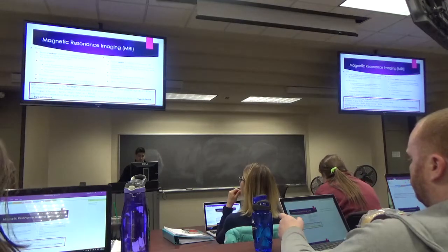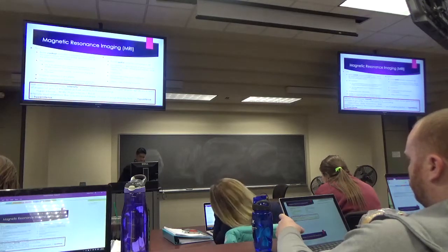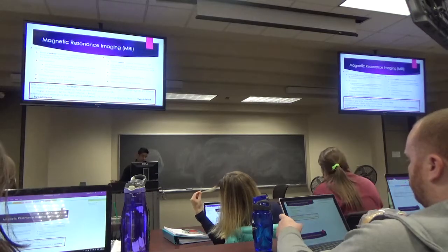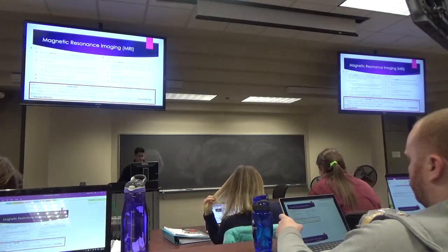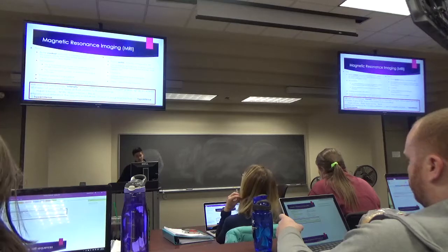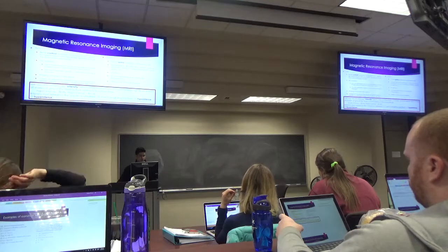And with that, there are also safety issues. You guys probably heard a lot of stories about MRIs being strong magnets. Things get thrown across the room. That is true. People have died from that in the past. You can find articles on that easily about oxygen tanks, where a nurse or something will wheel it into the room and it goes flying across. I mean, it's killed people before, so this is something, again, the tech should be very, very aware of. But if you guys are hanging around with a patient, you walk into the MRI room, just be sure to keep that in mind about any magnetic objects with you or on you or around you at the time.